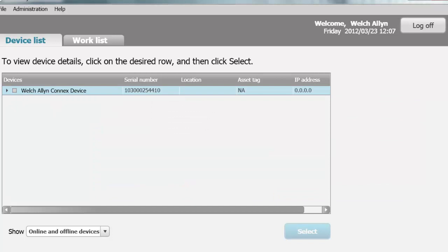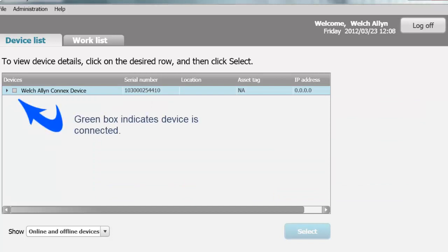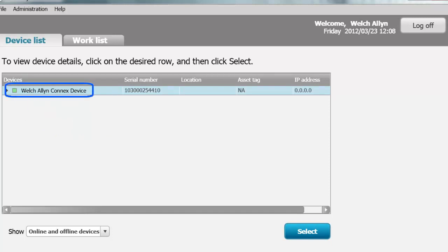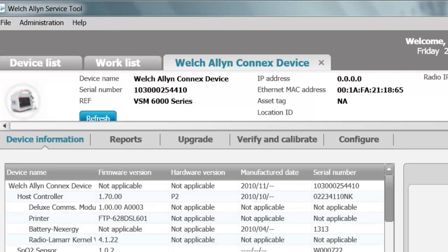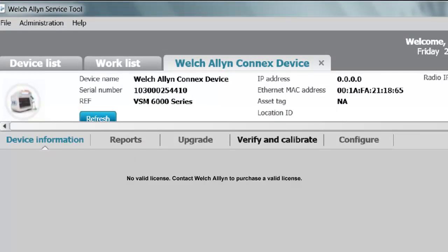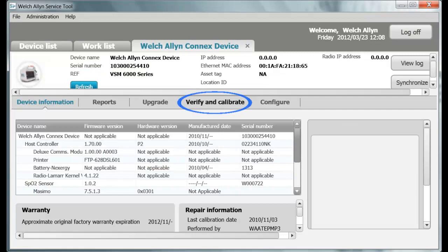To confirm which Service Tool Package you are running, with the Service Tool open, connect a device to the PC with a USB cable and double-click on the device. When the Device tab opens, click on the Verify Calibration tab. If it informs you that you need a license, the Silver Package is active because you cannot calibrate the device with the Silver Package. Otherwise, the Gold Package is running.